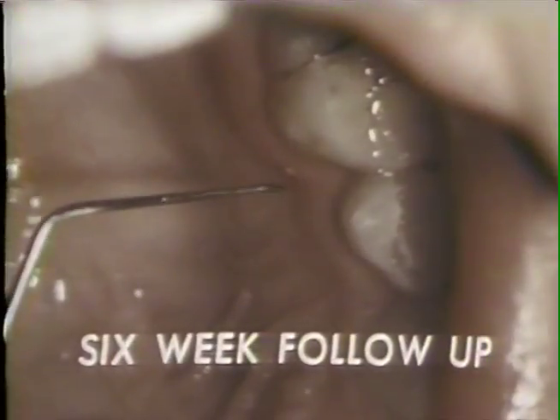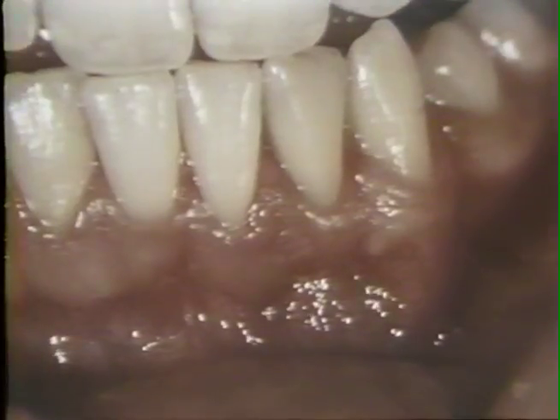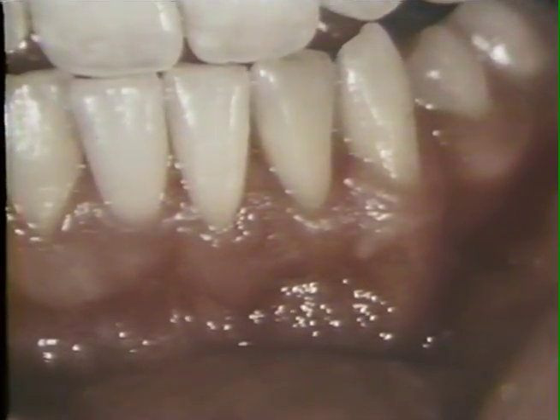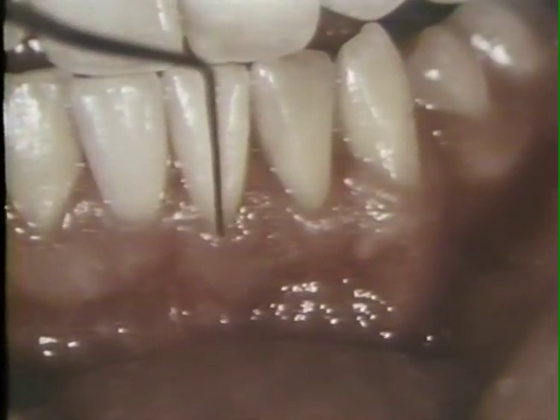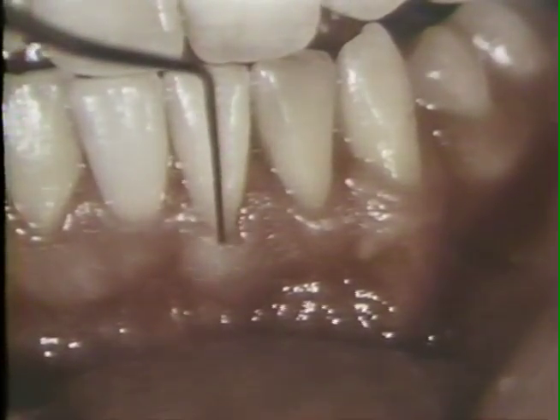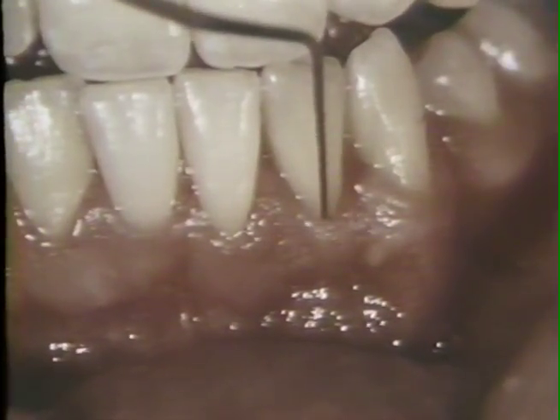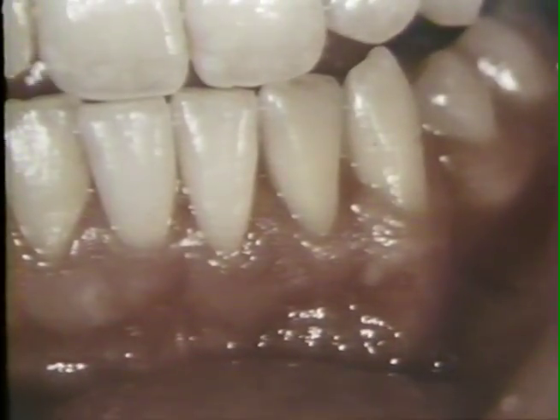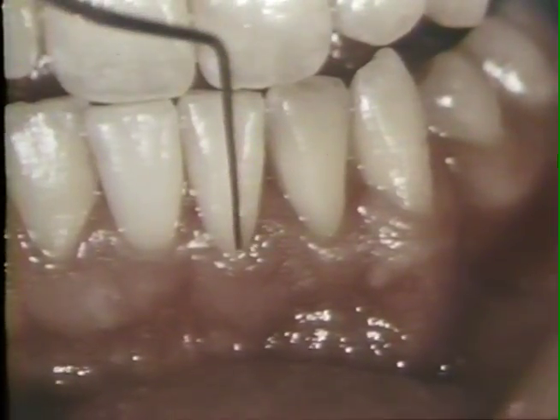Six weeks after the surgery, the donor site in the palate has healed completely. The aesthetic results at the site of surgery are excellent. Notice also that there is a shallow gingival crevice with typical blanching when probing to the bottom of the crevice. The free gingival margin is approximately at the cementoenamel junction and the gingival sulcus is about one millimeter deep, both for the central and lateral incisors.